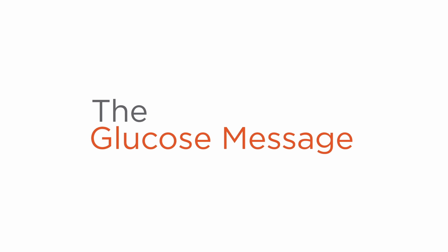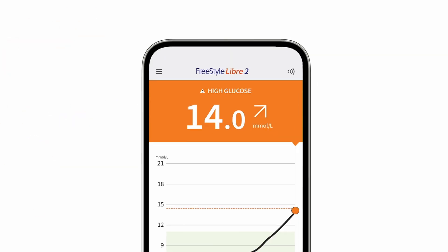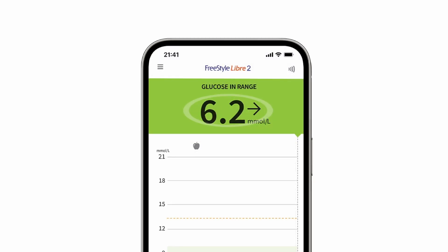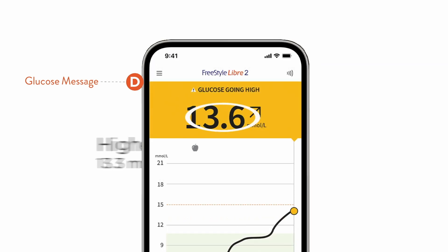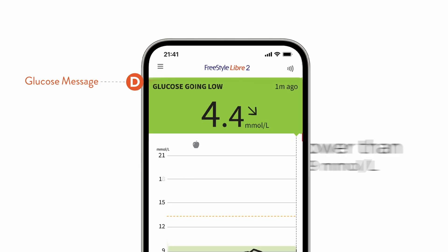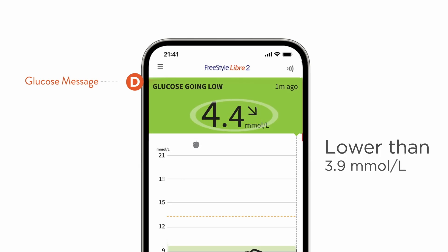The final piece of information on the screen is your glucose message. A message may appear when glucose readings are high, low, or in range. A glucose message may also appear if your glucose level is projected to be higher than 13.3 mmol per liter or lower than 3.9 mmol per liter within the next 15 minutes.